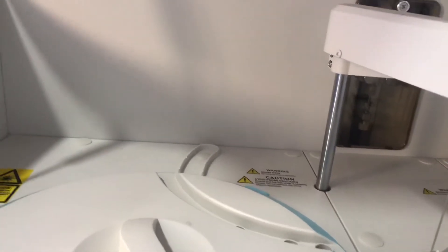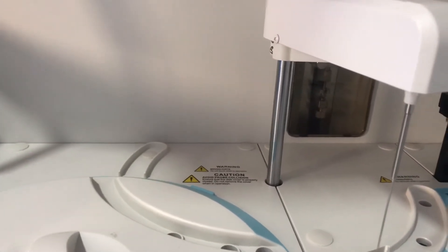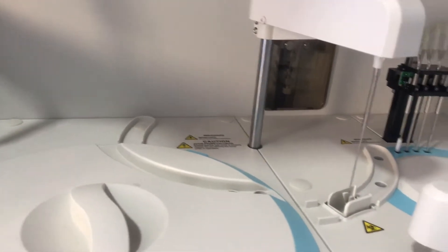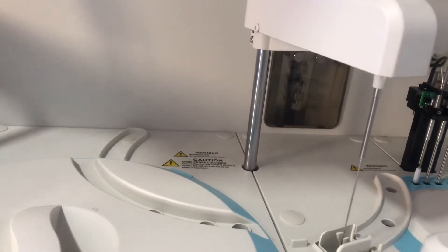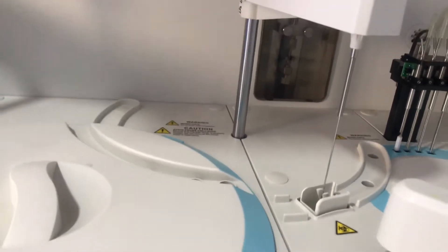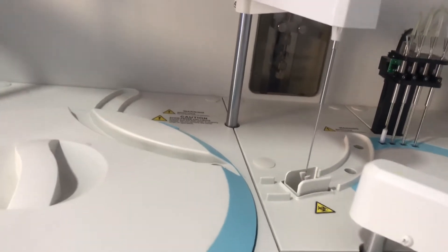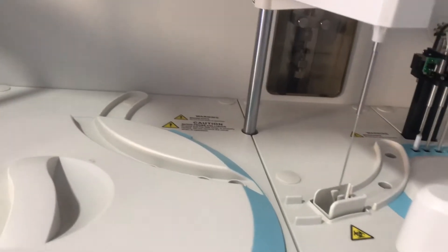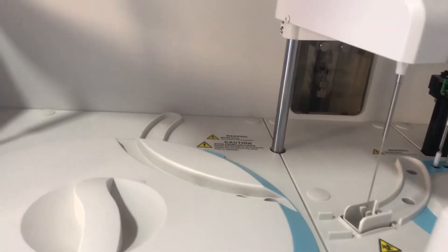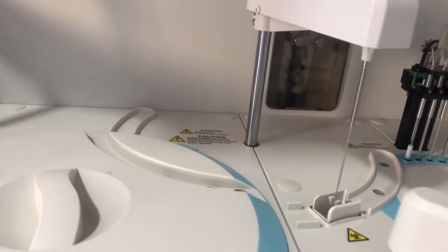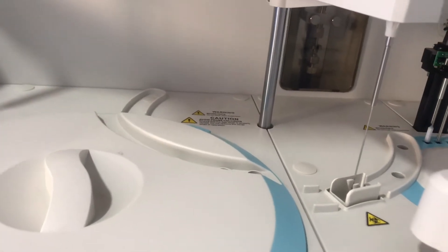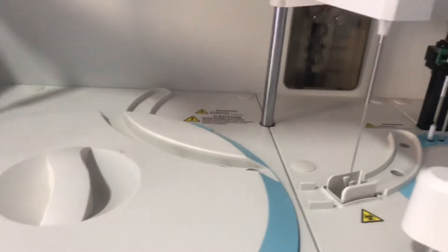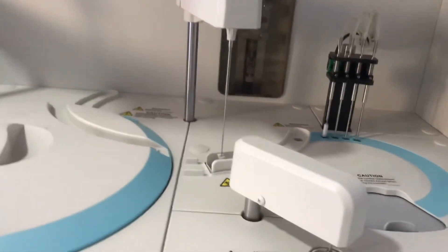Apart from that, it has level detection and tracking. It's able to tell the liquid level in the sample tube or the reagent bottle, and this also helps it to know how low it should go to be able to pick a specified amount of reagent or sample. That's about the aspiration assembly.